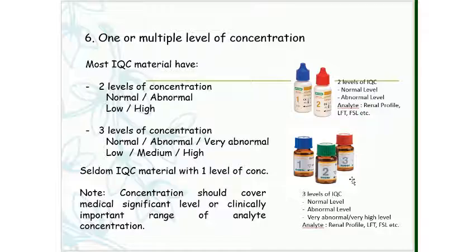And we seldom get IQC material with one level of concentration. And please take note that the concentration should cover the medically significant level or clinically important range of analyte concentration.